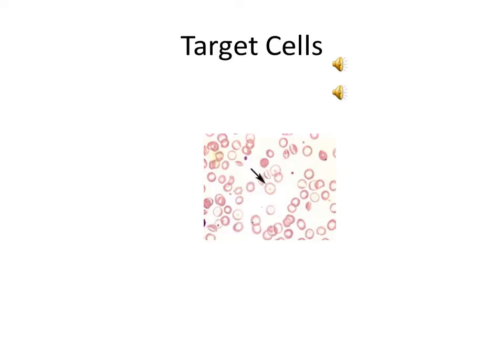The cells being pointed to in this picture are red blood cells, specifically target cells. They're a result of an increase in the red blood cell surface membrane. Target cells are also referred to as bullseye cells or Mexican hat cells. They're seen in many types of anemia, however they're most prominent in hemoglobinopathies, thalassemias, and liver disease. Depending on what laboratory you work at will be the way that you will grade them as to how many you see per field. That will be the same with all of these different shapes of cells that we're going to go over in the next few slides. Depending on what laboratory you're at will be how you grade the amount of these cells that you see.